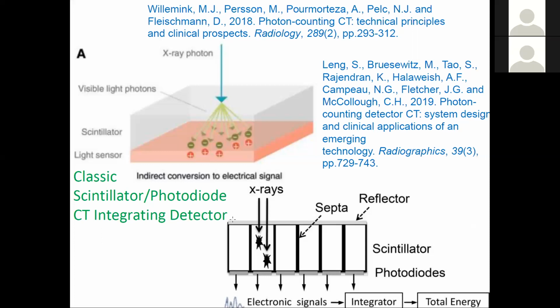But despite that, you can make a system where usually the residual number of X-rays making it through the patient, so that you're making your transmission measurement, are enough that the errors on that can be small compared to electronic noise. It's only when you have a low residual flux, which can correspond to your low dose case when you turn the tube down intentionally, that you start to have issues. But if you have a higher signal to noise, then your electronic noise becomes negligible, and this kind of system is just fine. And this is what CT was built on.